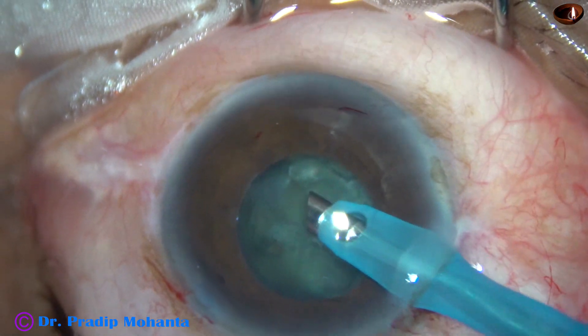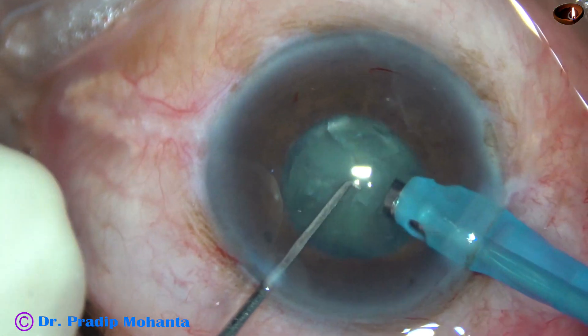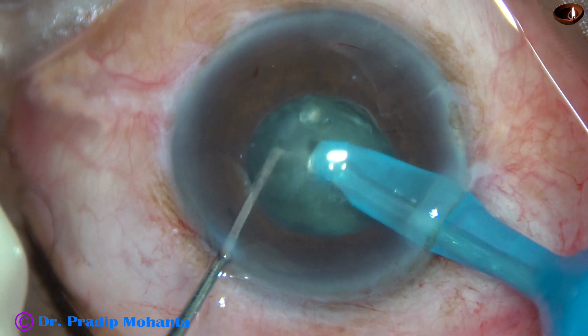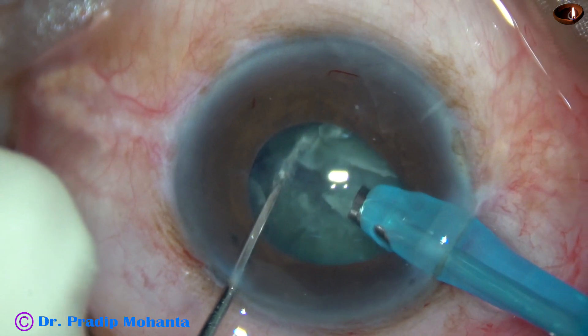After aspirating a bit of cortex, I turn the handpiece, make the bevel up, bury the tip into the substance of the nucleus, and chop it. This is a cataract with grade 3 nucleus sclerosis, and chopping was easy.